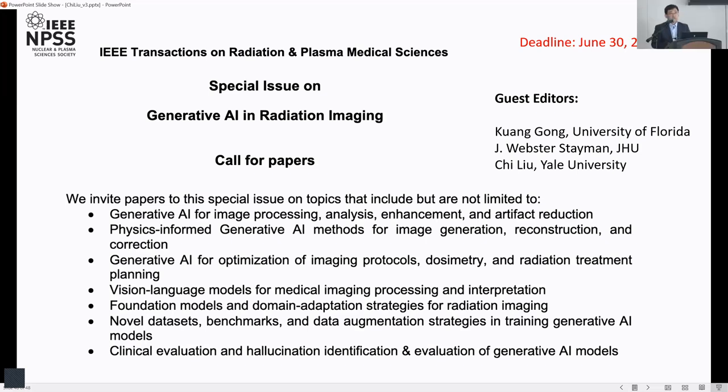Right, it's a good question. Right now, if the segmentation network gives us a segmentation of the lesion, we take that into consideration. For example, when we sample different patches, if one contains the segmented lesion, we give it a higher weight based on the probability. If for whatever reason the segmentation misses that lesion, we just don't give a higher weight. So I would say we're probably not losing anything, but if the lesion appears in the segmentation, then it will get a higher weight.